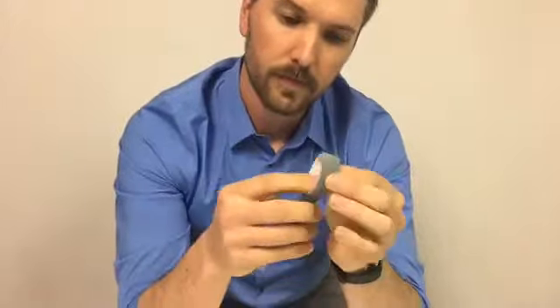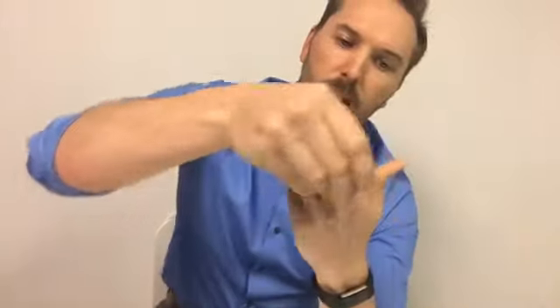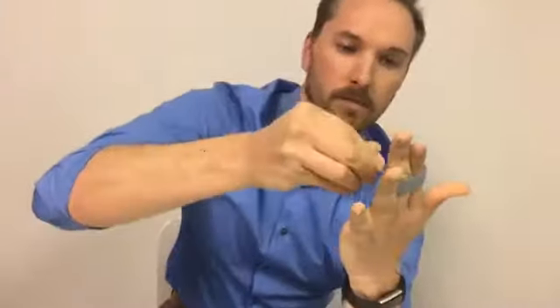What you're going to want to do is unstrap the Buddy Loop, take the loop and put it around the injured finger, then simply wrap it around the finger next to it, and strap on. This material is made of hook-receptive material, so it will strap anywhere you want — fitting many different finger widths and sizes.